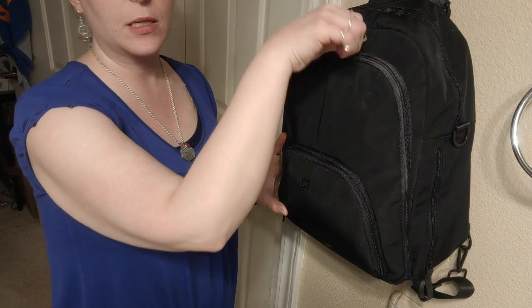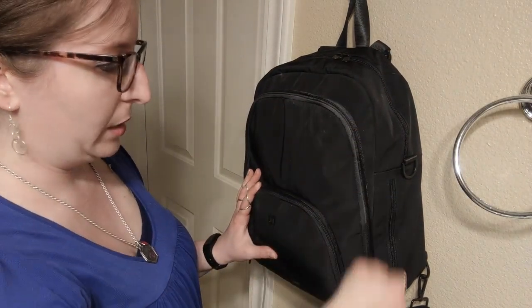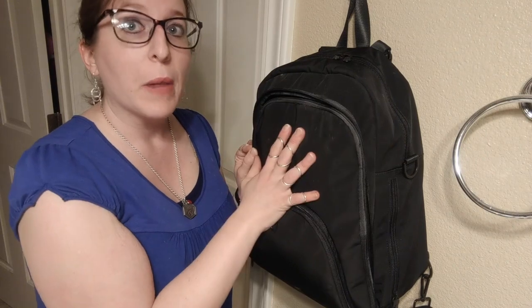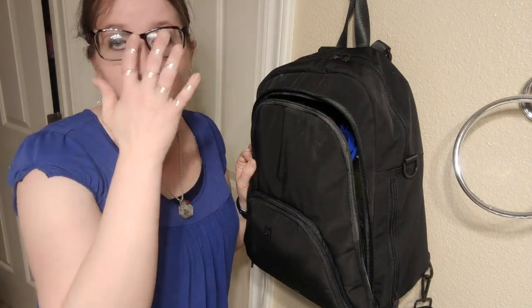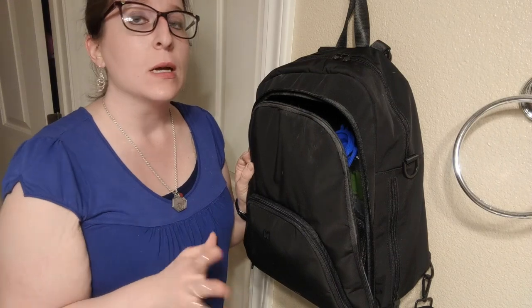So this is the pocket that the feed and pump go into. Now every pump is a little bit different. This Mighty Pack is supposed to be universal for all feed pumps, IV pumps, all of that. It's not entirely geared towards my particular pump, but I've managed to make it work, and it works fine.